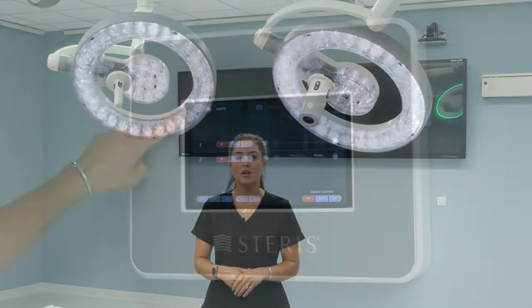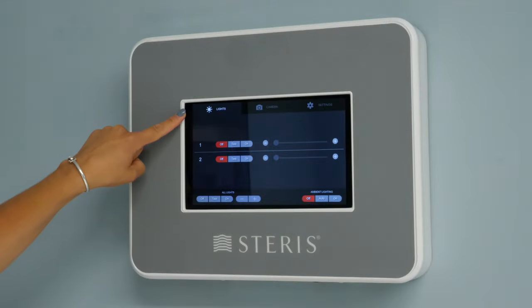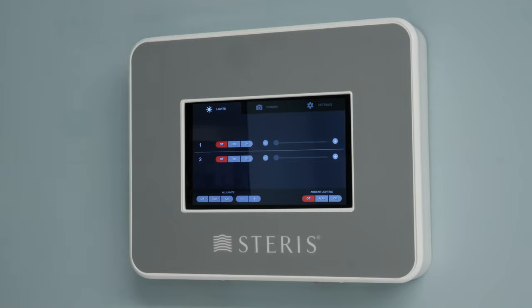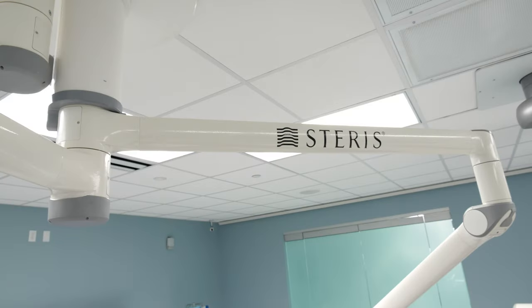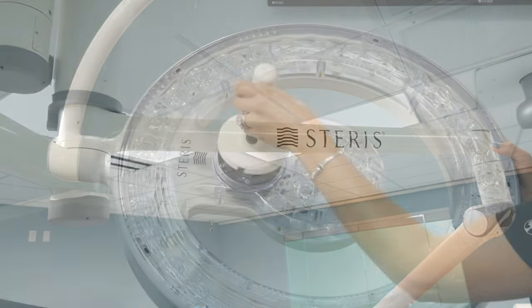Hi everyone, my name is Allison Meyer and I'm a local account manager with Steris. I'm here today to provide an in-service for your A-series surgical lighting system. We'll review the controls, the suspension, and the light head.